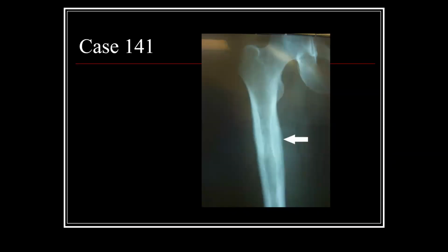Well, what about this lesion? Here's another example of how to look at these sorts of lesions. This is obviously affecting the cortex, but I think you'd have a hard time defining where it starts and where it stops. There's really a very ill-defined nature to a border like this. So this is a nice radiographic example of the permeative type of pattern of margin with a bit of cortical sclerosis and so forth going on here.